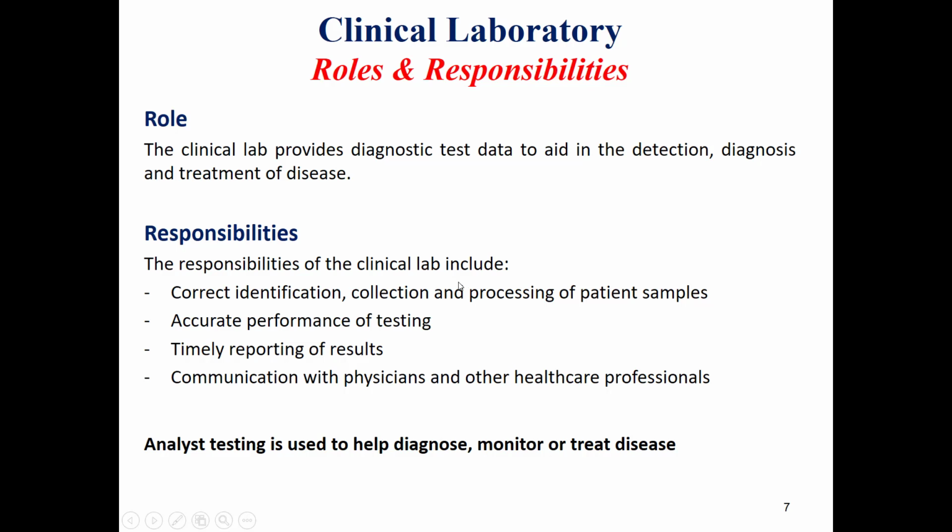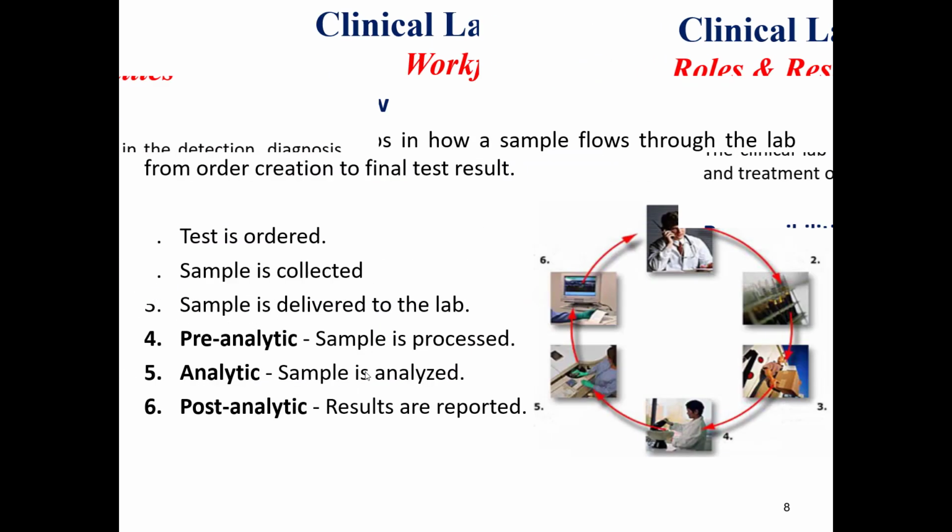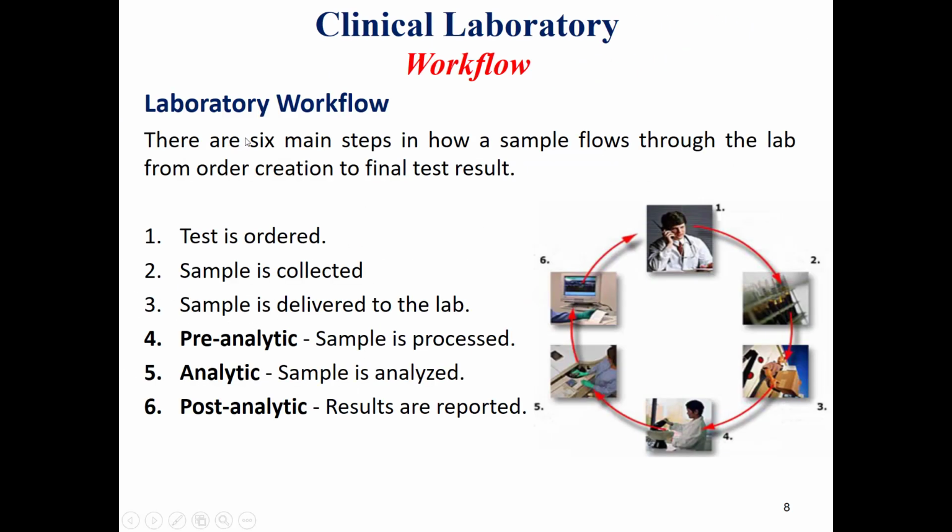The responsibilities include correct identification, collection, and processing of patient samples, accurate performance of testing, timely reporting of the results, and communication with physicians and other healthcare professionals. The workflow in a clinical laboratory can be separated into 6 main steps. The first step, the test is ordered. The second step, the sample is collected. The third step, the sample is delivered to the lab.